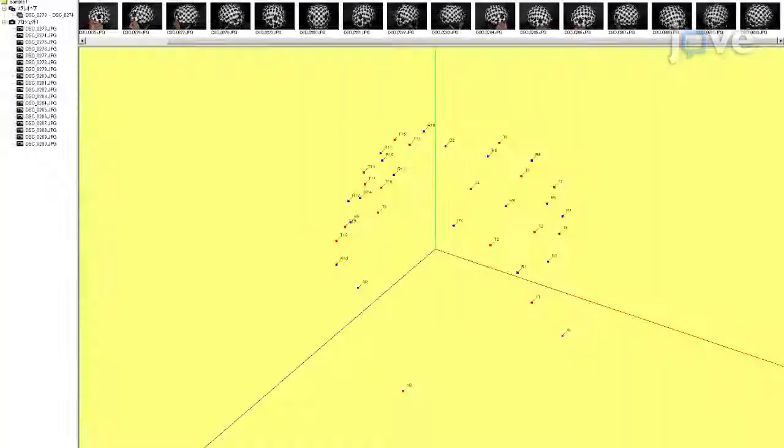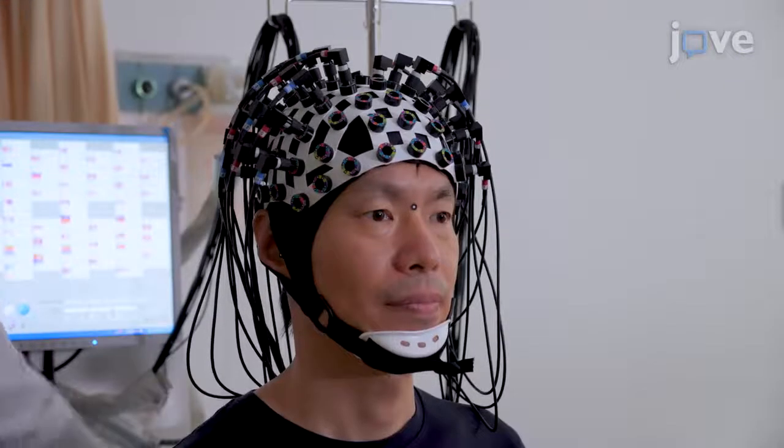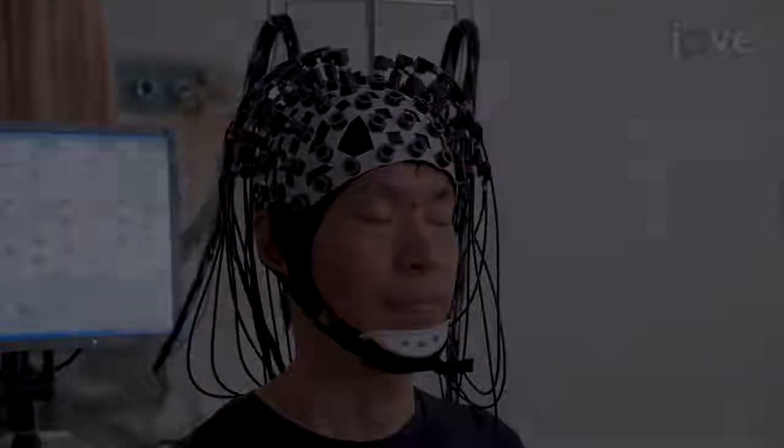After scanning picture data for the entire head, determine the spatial coordinates of the subject by auto-measurement and save the data as origin and other files. To perform an fNIRS analysis, have the subject get into a comfortable position.